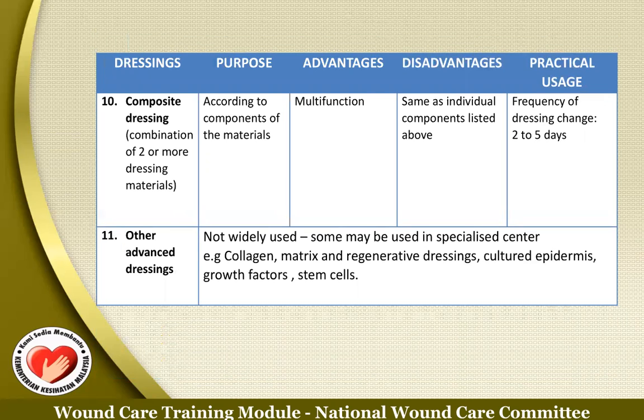Composite dressings are a combination of 2 types of dressing material. Actually, the purpose will depend on what we use. Advantages, it will be multifunctional. Disadvantages, it will be the individual components listed above. I will change the dressing every 2 to 5 days.